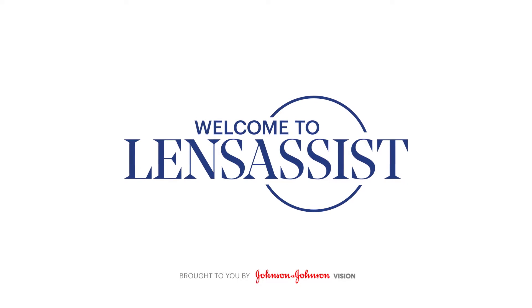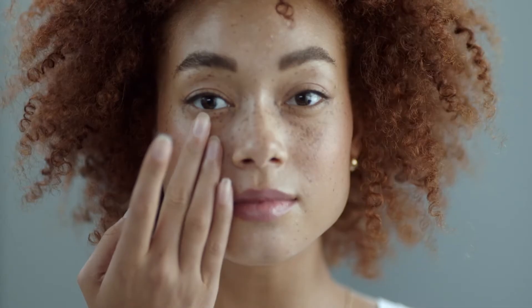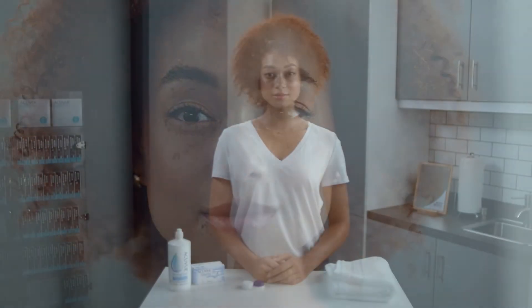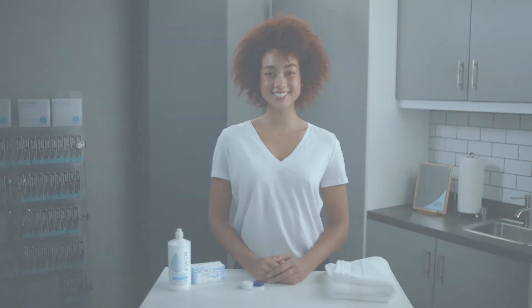Welcome to Lens Assist. Feeling nervous? Don't be. This video will prepare you for your first week wearing contact lenses. We'll be walking you through everything you need to know, like how to safely put them on and take them off, and more. Follow along as we go and when you're done, you'll be amazed at how quickly it becomes second nature. If at any point you need more time or assistance, simply pause the video or call the office staff for help.